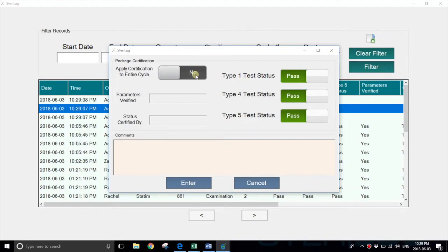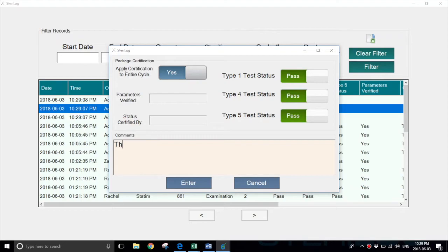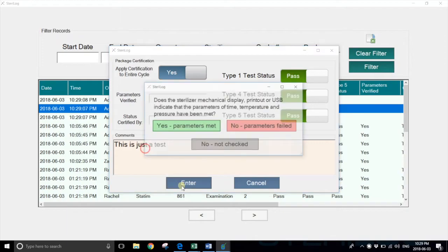If Rachel has verified that the entire cycle has passed, she could set this switch to yes, key in some notes, and hit enter.